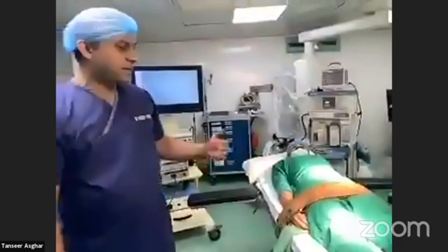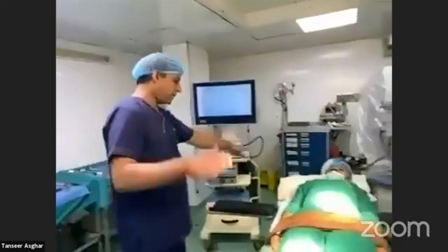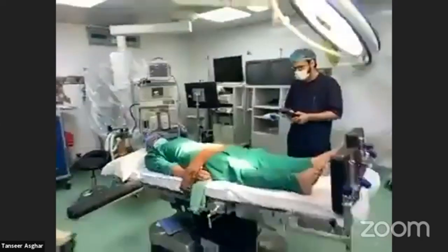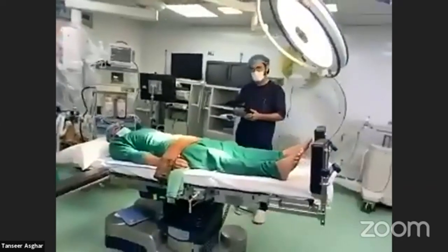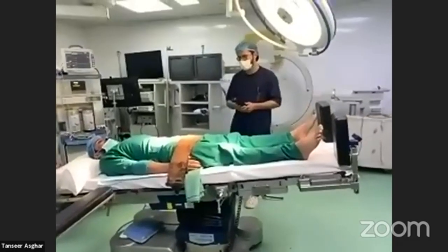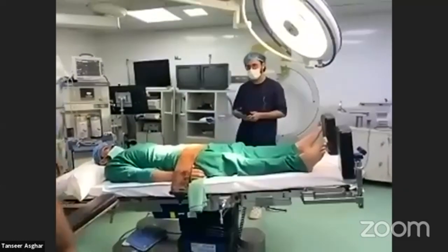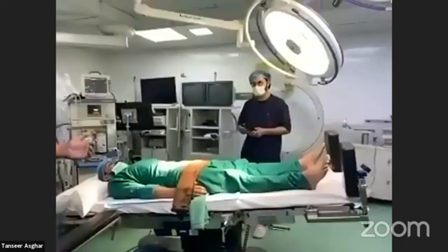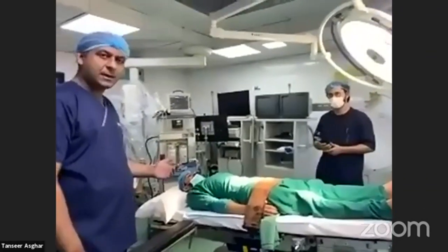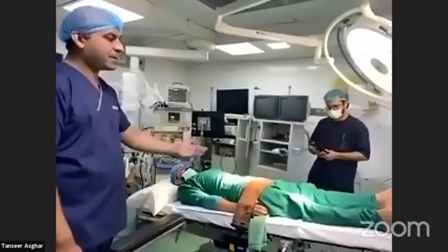This position is called Trendelenburg — head down. You can tilt the patient 15 to 35 degrees. This position is used in laparoscopic appendectomy or laparoscopic gynecological procedures where you work in the pelvis, as it allows the viscera to move away from the operative field.